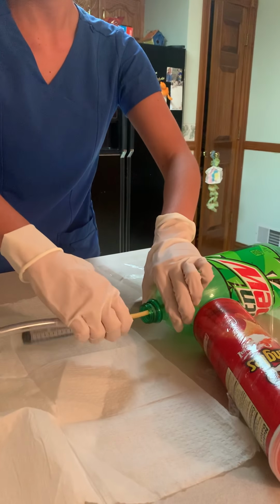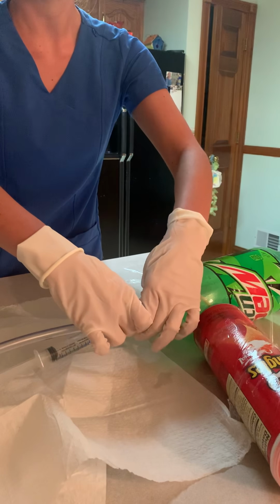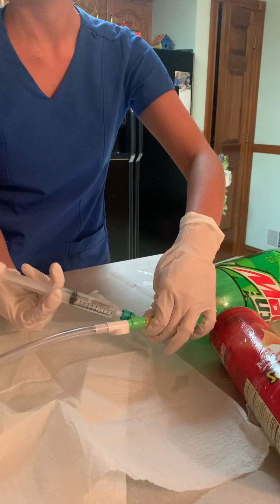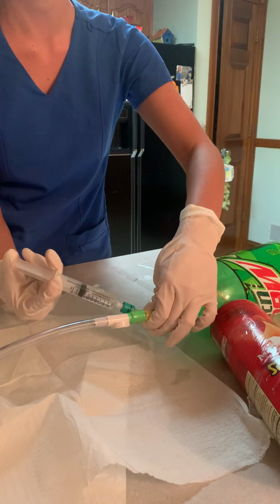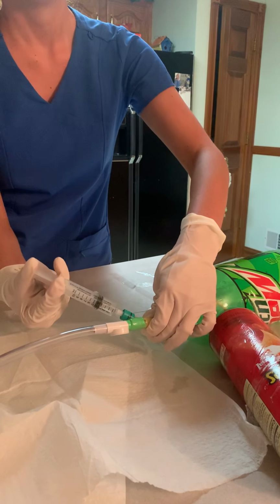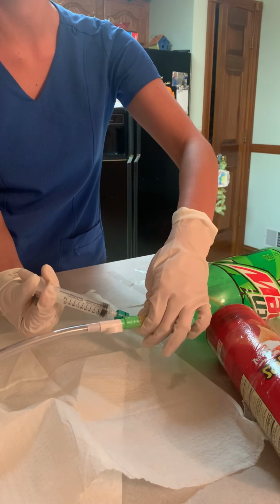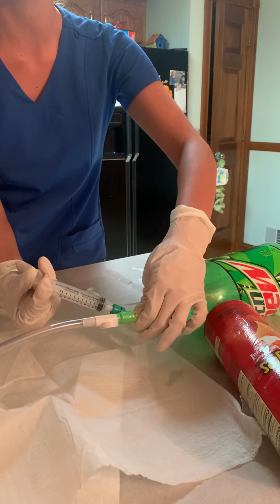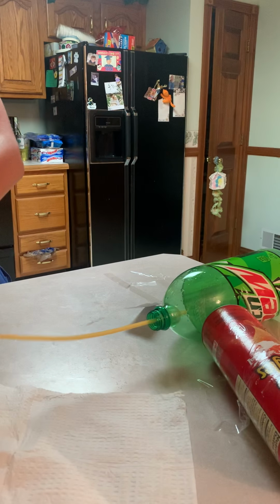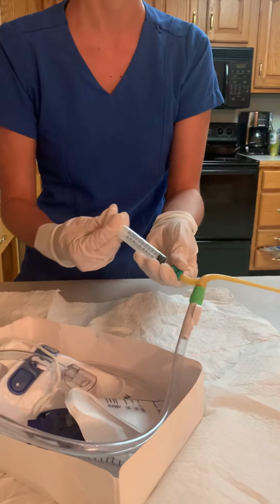And we're going to go all the way up to the bifurcation. And once we're there, we're going to stabilize that. And then we're going to inflate our balloon all the way. Okay, and then once we do that, we're going to pull all in one motion to the foot of the bed until our balloon catches. And then we can remove our syringe.